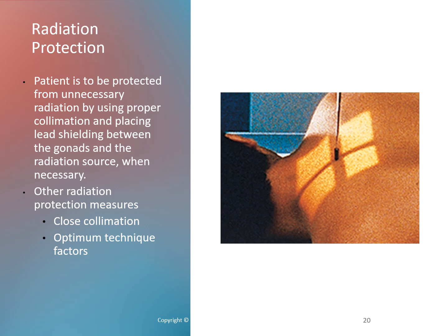You should be adjusting your technique for pathology and for habitus. So increase the kilovoltage if you find that your patient is hypersthenic. Decrease the kilovoltage if you find that your patient is arthritic, geriatric, and/or asthenic. Okay? Using an optimal technique ensures that you get a good deviation index, a good exposure index, and you don't have to repeat for motion.